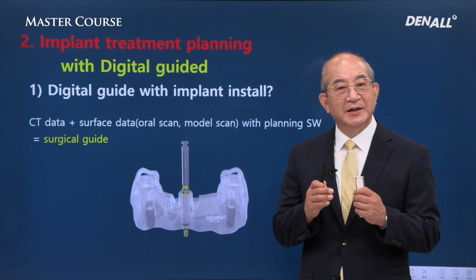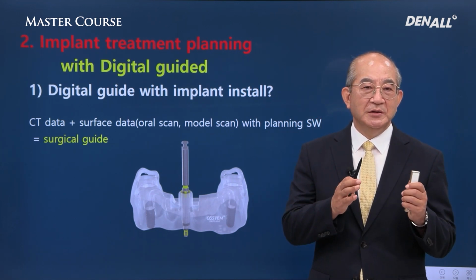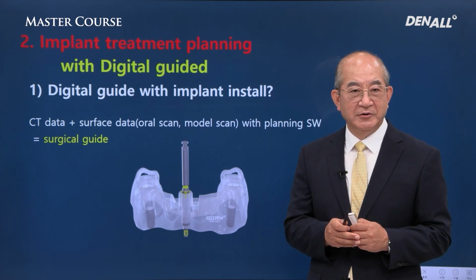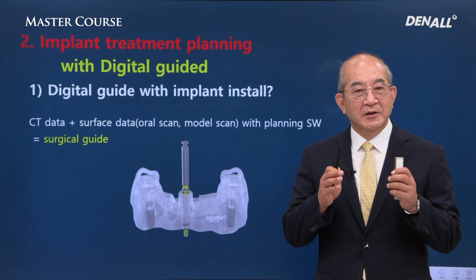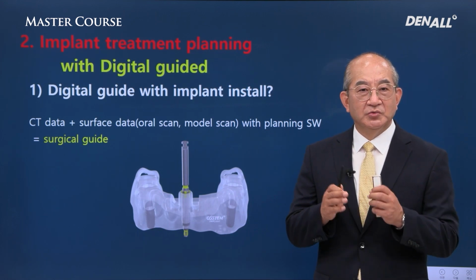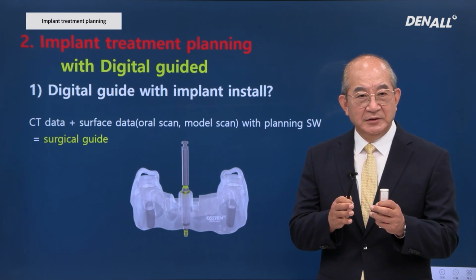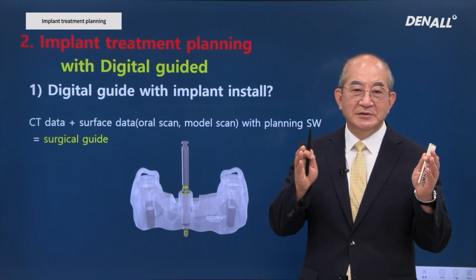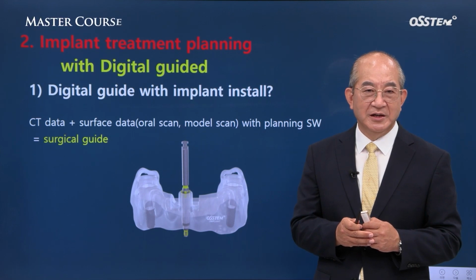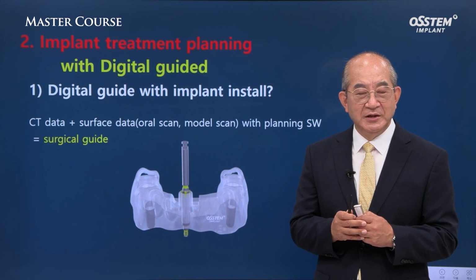Digital dentistry-driven implant placement is based on treatment planning using these digital techniques. The most basic is CBCT data and surface data of oral cavity. A mixture of these digital data leads to surgical guides, and it will be digitally driven treatment planning.